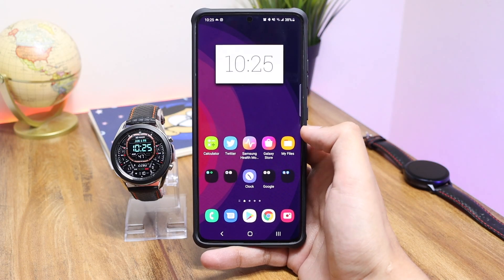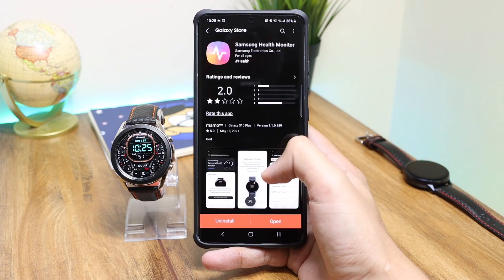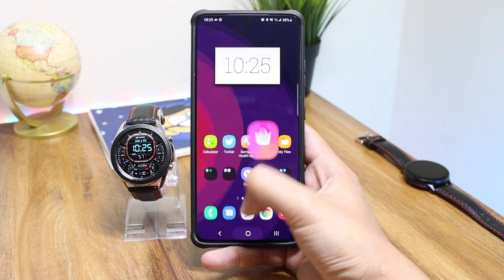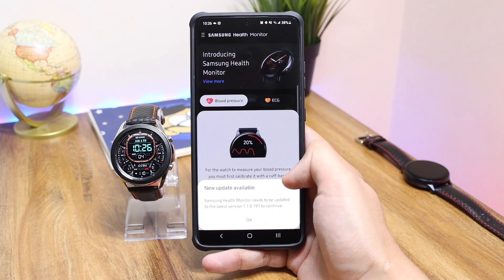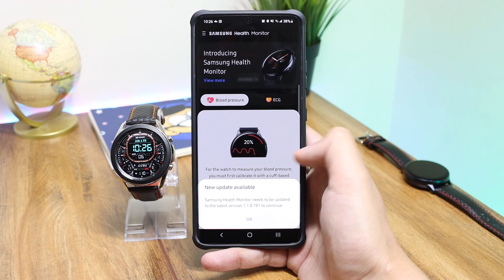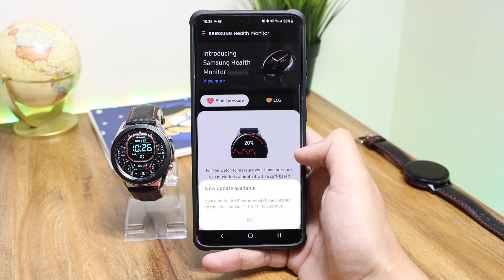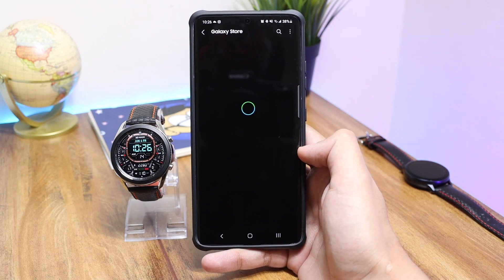Samsung recently updated their Health Monitor application, which is essential to monitor blood pressure and ECG on the Galaxy Watch 3 and the Watch Active 2. With this new update, the previous version has stopped working. Whenever you open the Samsung Health Monitor app, you get a notification saying it needs to be updated to the latest version, which is 0.191, and tapping OK takes you to the Galaxy Store to download this update.